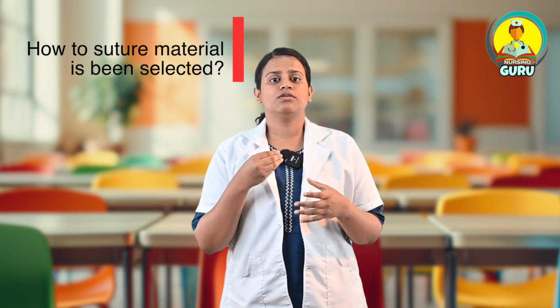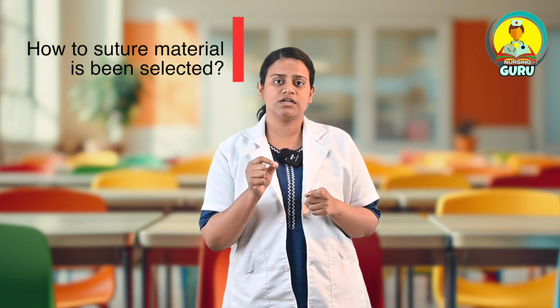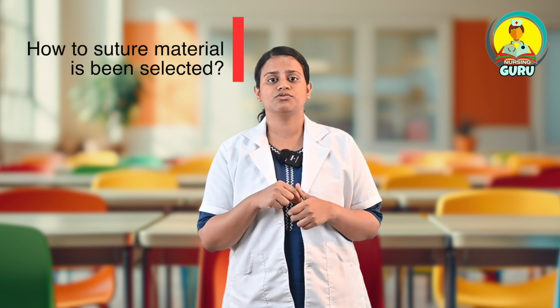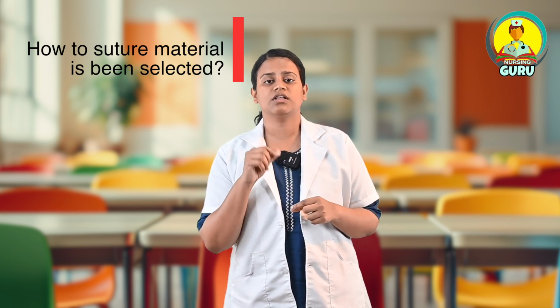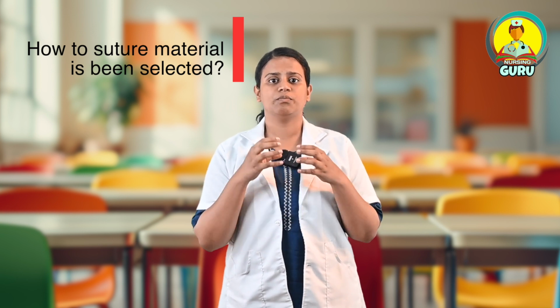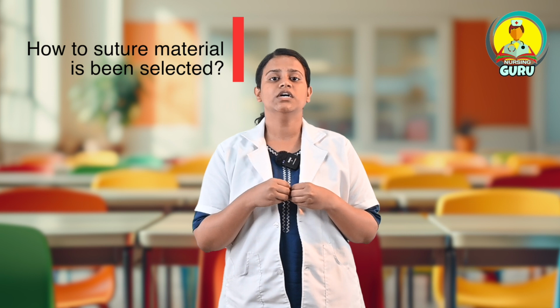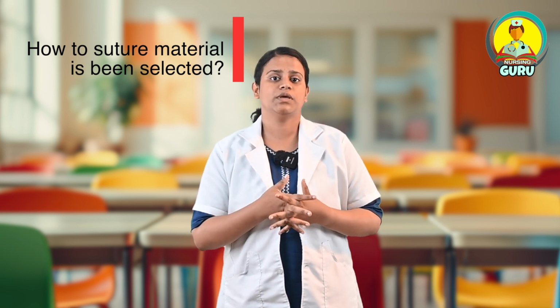Fourth one is the knot holding characteristics. Every single knot which we tie after the suture is very important to hold together, because if the knot is not tied properly, or because of the heaviness of the tissue or the smooth muscles of the tissues, this knot may loosen up and the wound may open again.